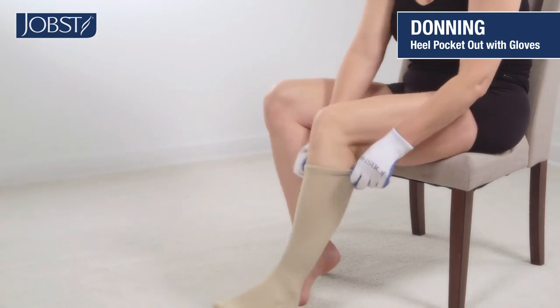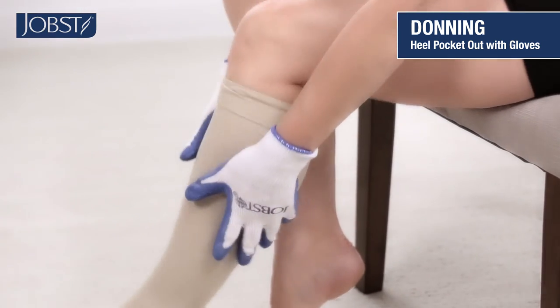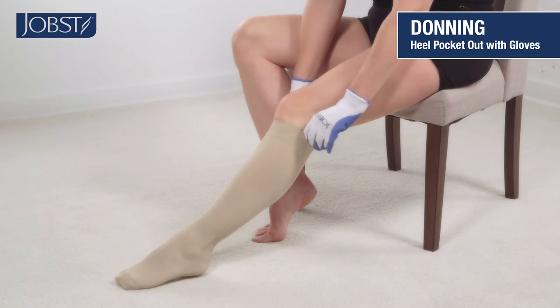Now you can go ahead and adjust your stocking — the gloves can help do this. Smooth the hosiery starting at your lower leg and work your way up until any folds are smoothed away.